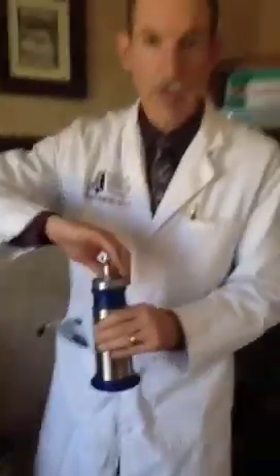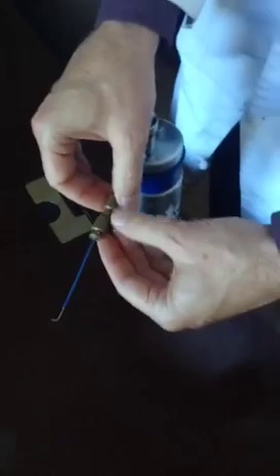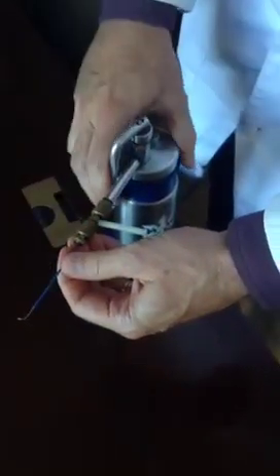So if it's in a liquid state, it is less than 300 degrees below zero. We have it set up here in our office. We use a very small nozzle to get it out, and this is just for blowing off water vapor that can come with it. Come with me.